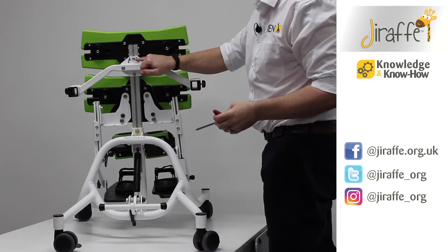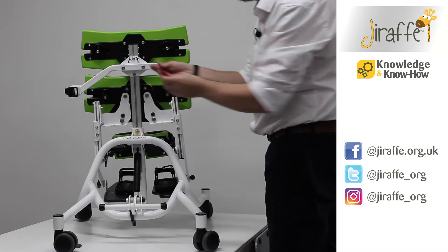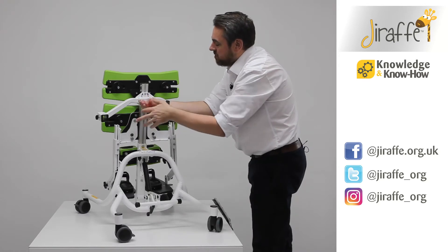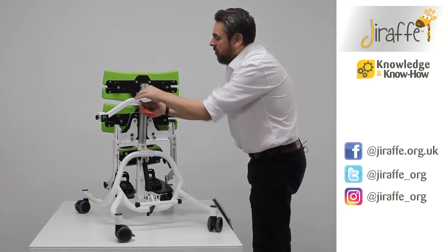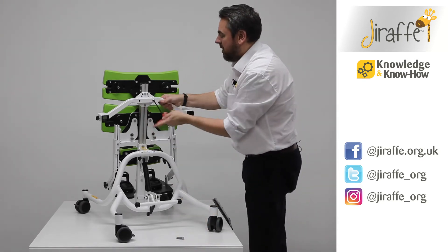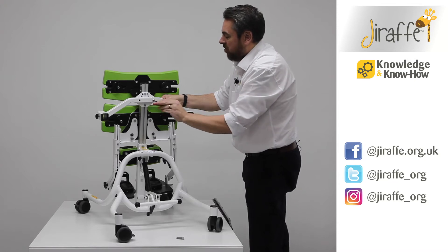We're going to need to change the orientation on our tray mounting bracket. There is a useful sticker which illustrates which orientation the tray support bracket should be in. Then we're going to go to the two large bolts on the front and totally remove them, making sure to put them safe whilst we're making the adjustment. Support the bracket as you undo the final bolt.